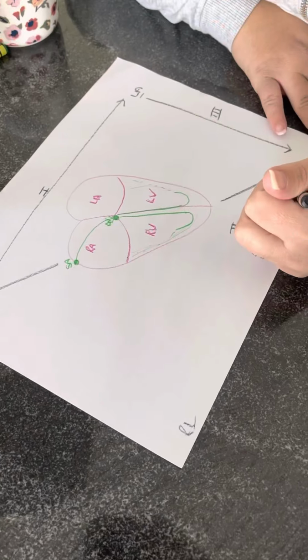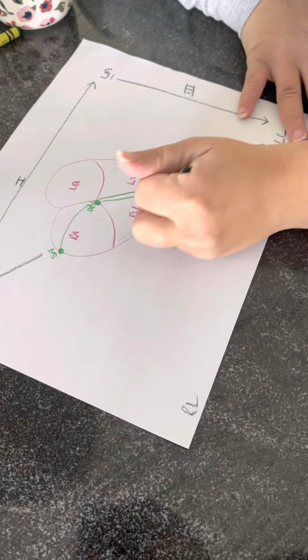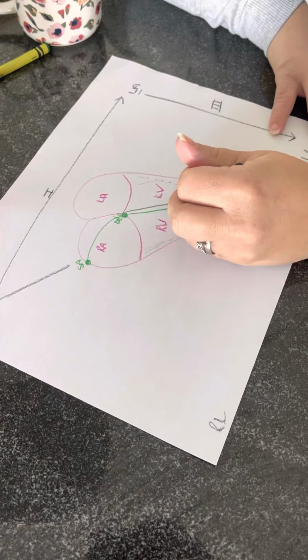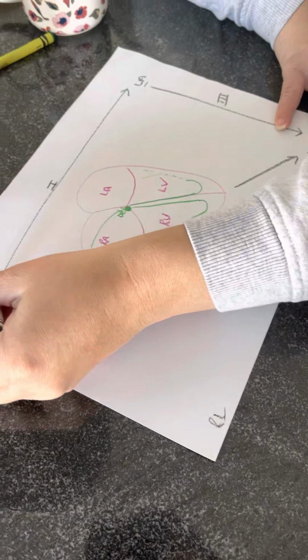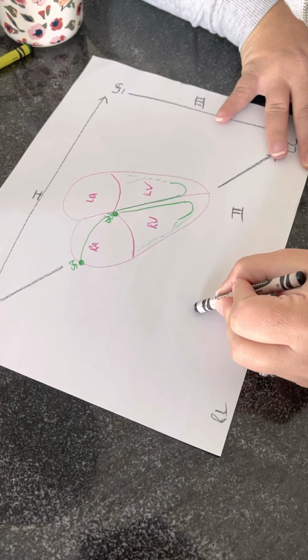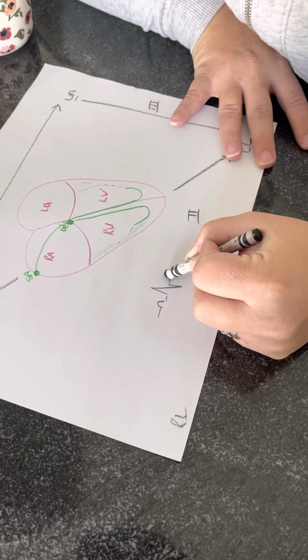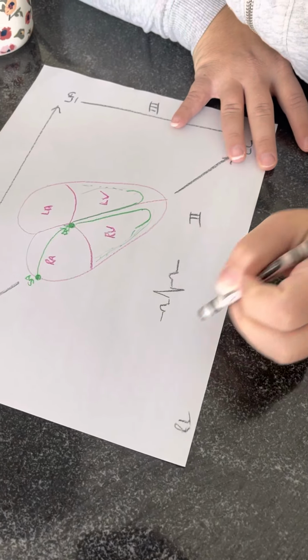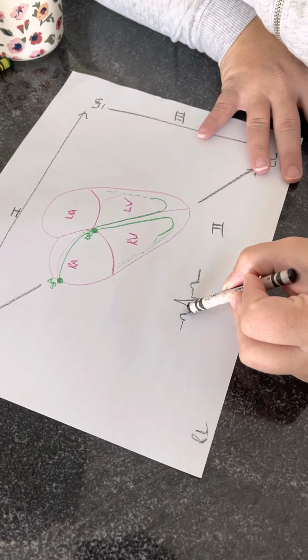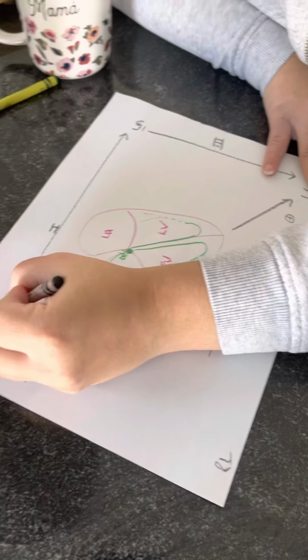Okay, so those are the limb leads. The thing about lead 2 is it goes directly down the electrical pathway of the heart. Okay, so the electrical pathway, SA, AV, bundle branches, Purkinje fibers, goes directly down the rhythm of the heart. So this is where you get the classic P wave, the QRS, and the T wave. Because the P wave is going to be this initial positive. So this is negative to positive is how it reads. Right, this is where these arrows are going.